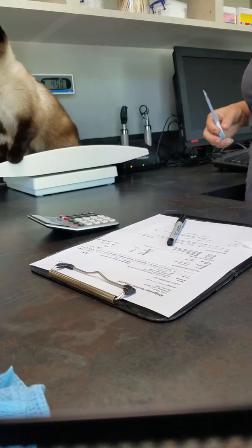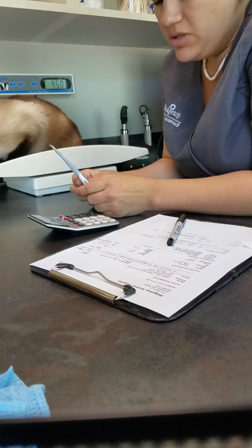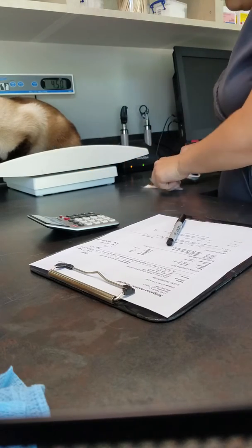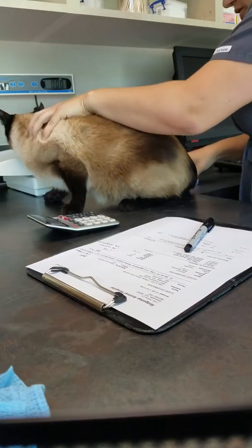So the last thing I could do is go ahead and check the temperature. So I use a new probe cover and I put some lubricant on it to help it to pass easier.